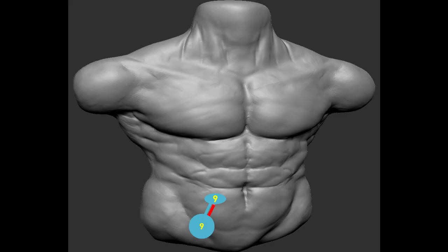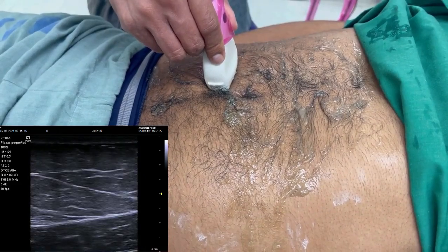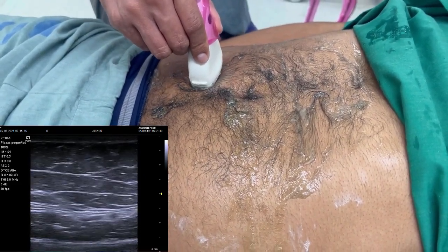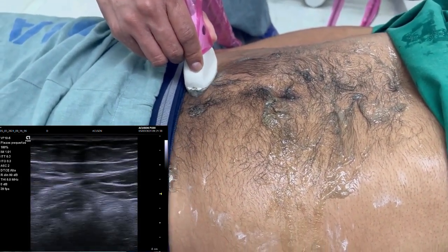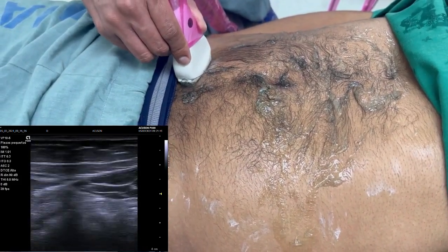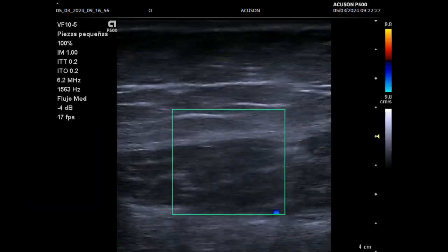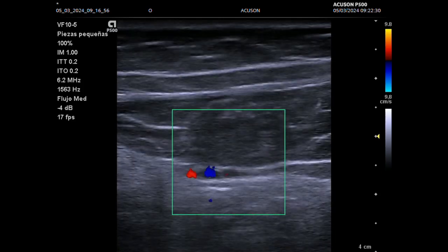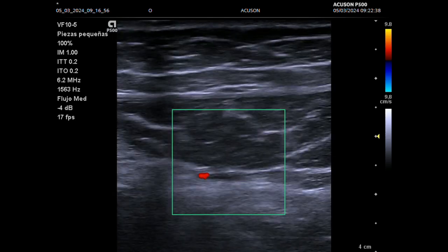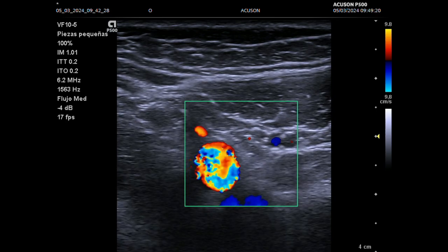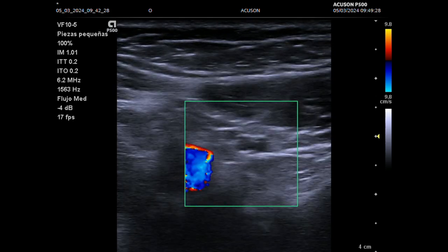In step 9, we evaluate the right inguinal area. We locate the right rectus abdominal muscle, then move caudally and laterally to identify the epigastric vessels, which lie posteriorly to the rectus abdominal muscle. If we use color Doppler, it is easy to see the epigastric vessels. Another structure we must identify are the femoral vessels. At this point, we ask the patient to perform the Valsalva maneuver to identify hernias in the inguinal area.